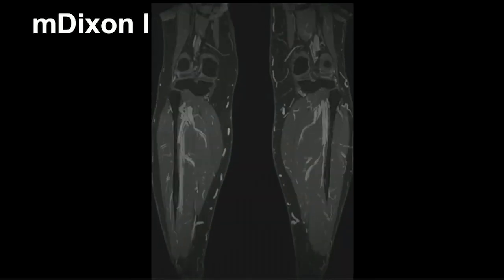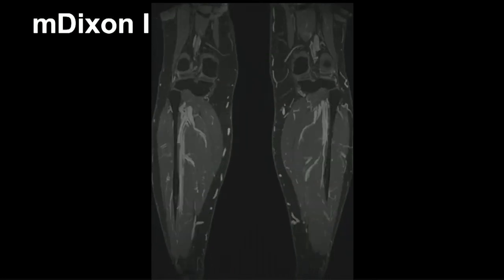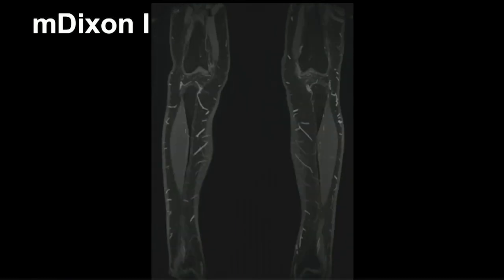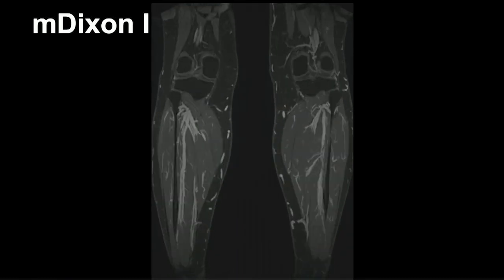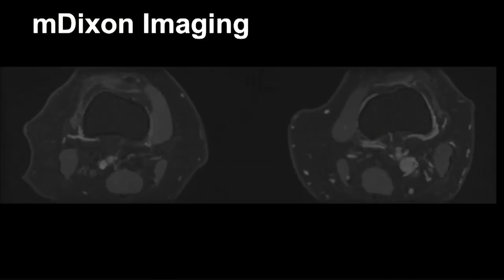And you can see excellent fat suppression. If it's not a technique that you've used a lot, then I would recommend at least acquiring all of the 4 images available for Dixon to look out for fat-water swapping, although I think that's a lot less of a problem these days than it previously was.